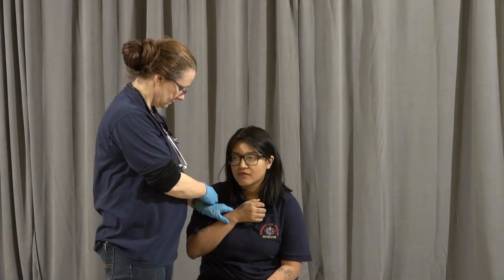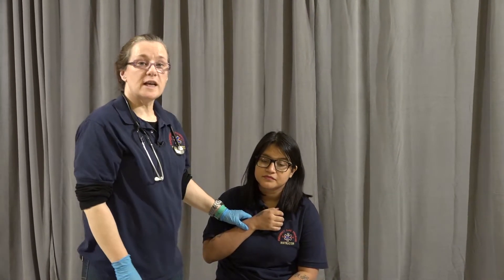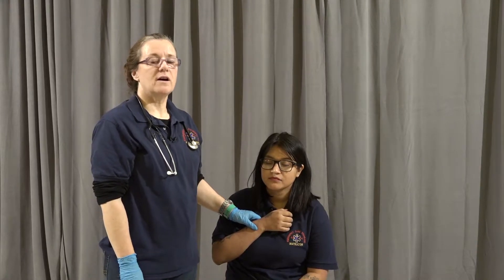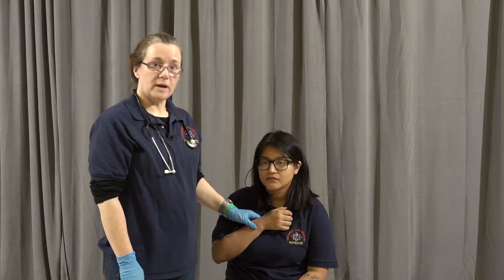If the respiratory rate is irregular, we're going to do it for one full minute. 30 seconds on the clock. During those 30 seconds, she took nine breaths. That gives me a respiratory rate of 18. She's unlabored and her breathing is regular.